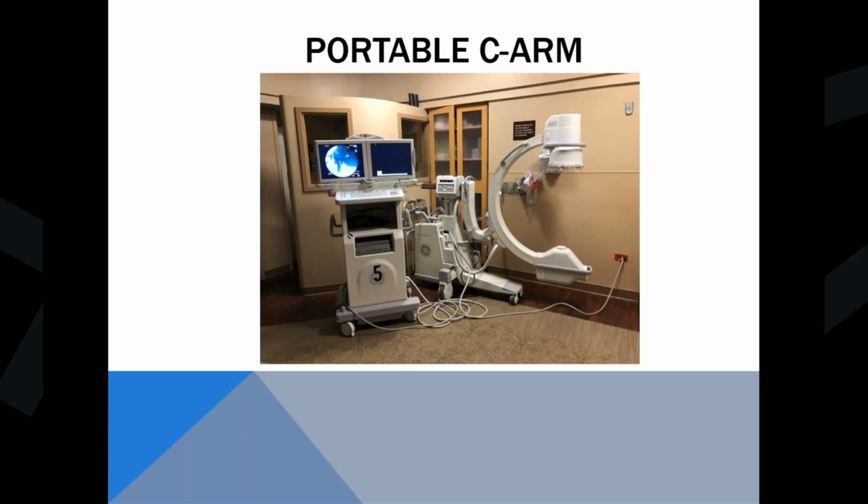As the run goes through, if you're going through a range of motion, you can change your dose based on your density. So if you're going from your wrist to your elbow, you can start off at a small dose, and then as you go up your arm to your elbow, the dose can increase so that it's able to do the range of imaging that you want. Otherwise, your elbow would be kind of blurry and would need some more dose. With cine or fluoro, it's able to adjust to the density of the area that it's looking at.